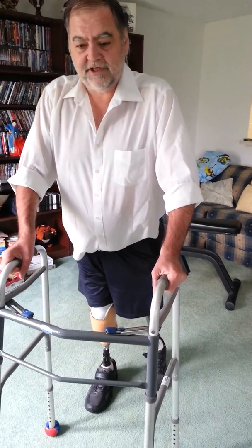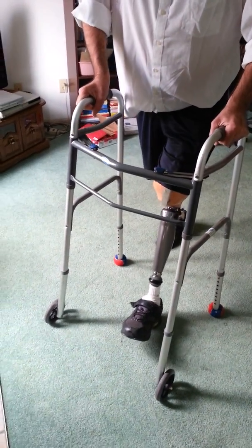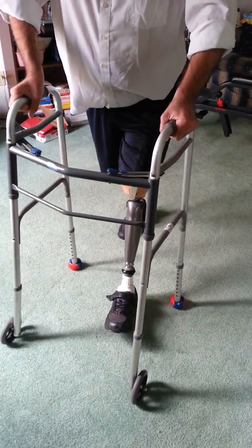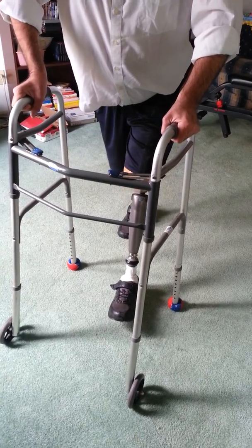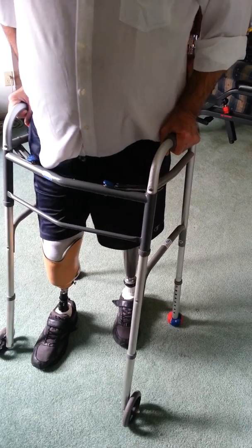So I go heel to toe, squash the bug, and there's a hyperextension on that knee. Of course, that would hurt if it was a real knee, but it's not a real knee, so it doesn't hurt. So I can walk on through that. And that's my first thing that helped me learn how to walk.